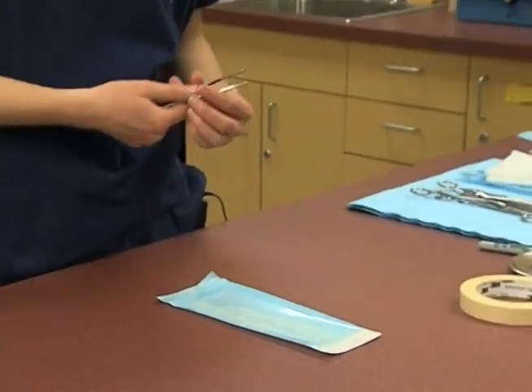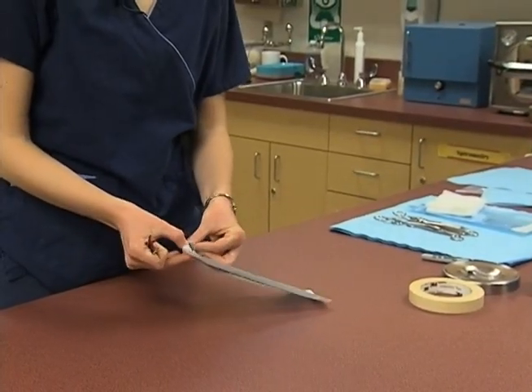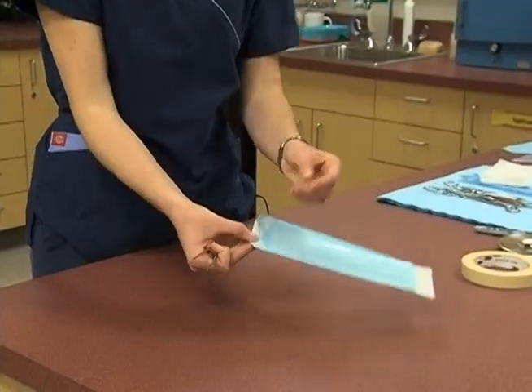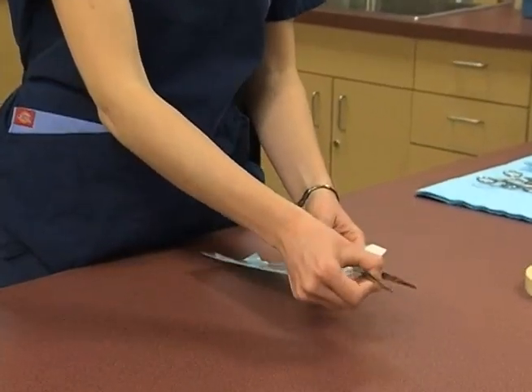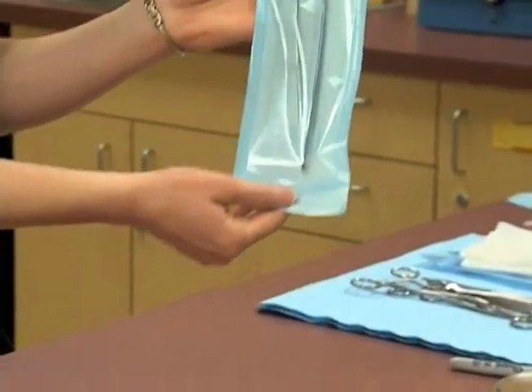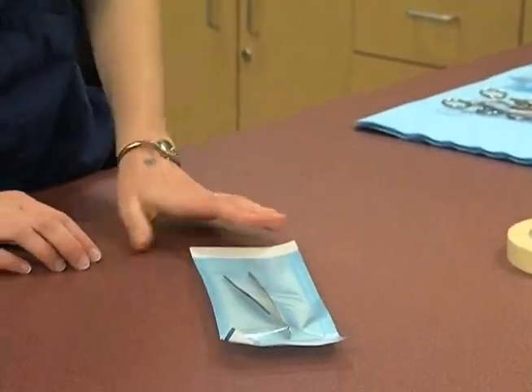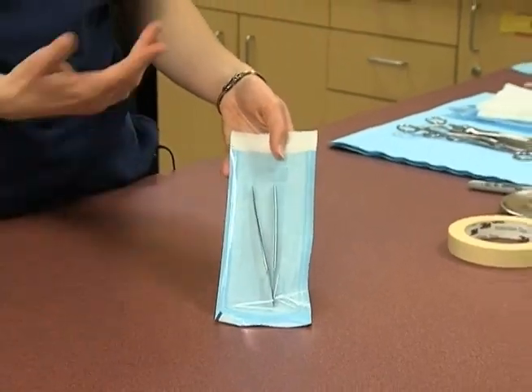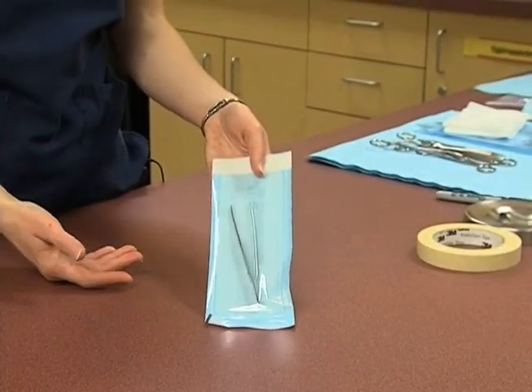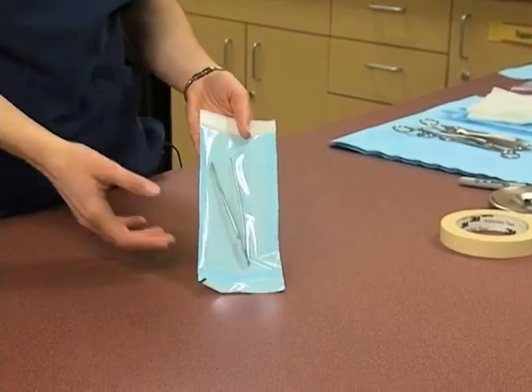When putting in instruments, one of the key things is that when we actually open them, they're opened in this direction. When we place an instrument inside, we want to put it handle down first. This instrument stays open by itself, so we don't need to worry about having any cotton in there. If we were placing an instrument in here with hinges, we would place cotton within the hinges.